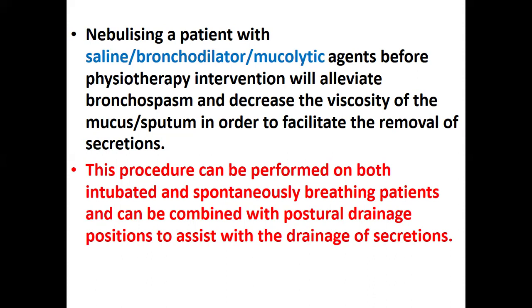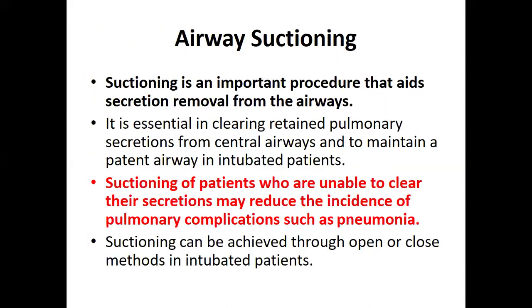This procedure can be performed on both intubated and spontaneously breathing patients and can be combined with postural drainage positions to assist with the drainage of these secretions. So that is the reason why you nebulize, and that is what the nebulizer does.